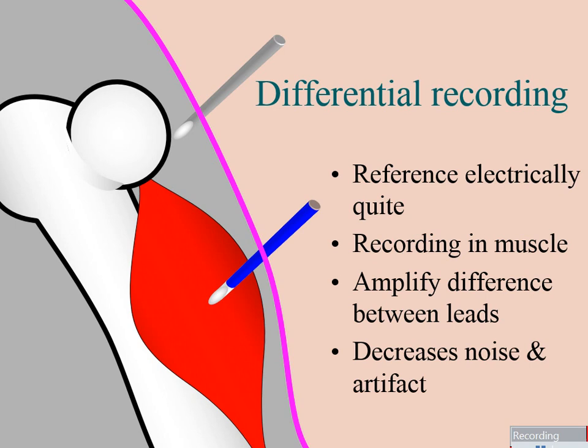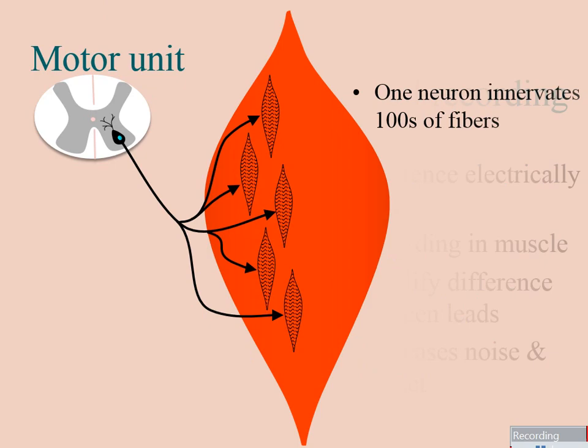And then we have one of those concentric electrodes. The outside is the reference, and that thin, tiny electrode surface at the point of the needle is our recording surface.